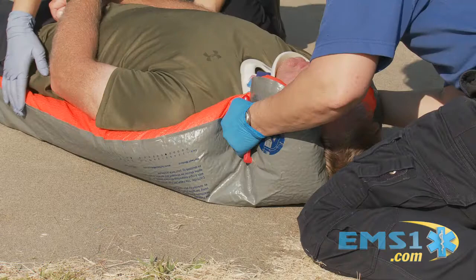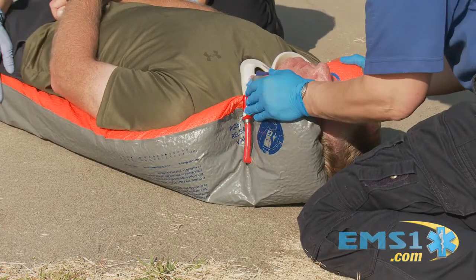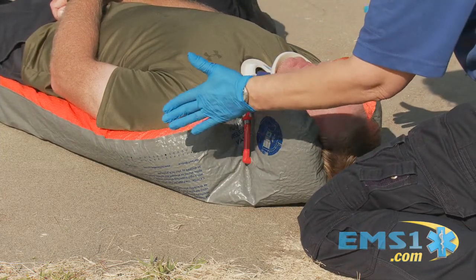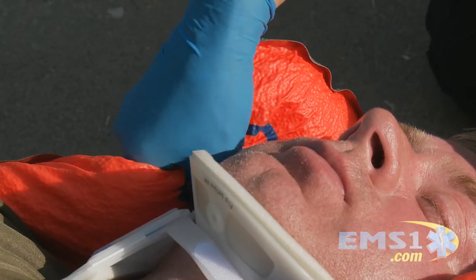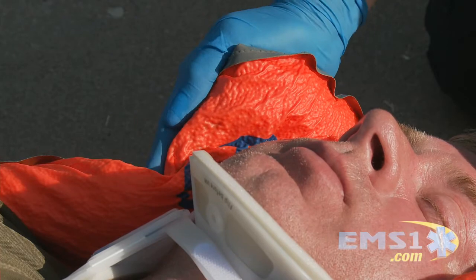I know a few of you are out there thinking, what happens if this gets punctured in the field? It's a vacuum device. Well, fact of the matter is, it's very easy to fix in the field. A little bit of duct tape, any non-porous tape, like an EKG pad. Take care of it right then and there. It comes with a vinyl repair kit, so when you get back to the station and have a little more time, you can fix it up right, it's good as new.